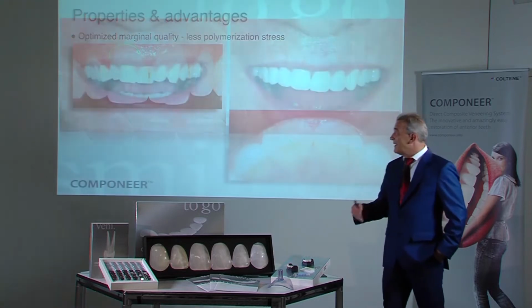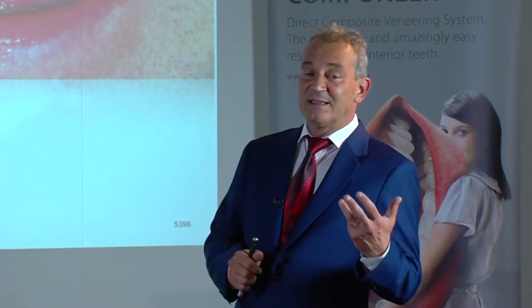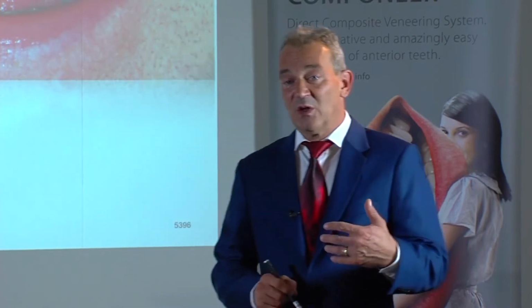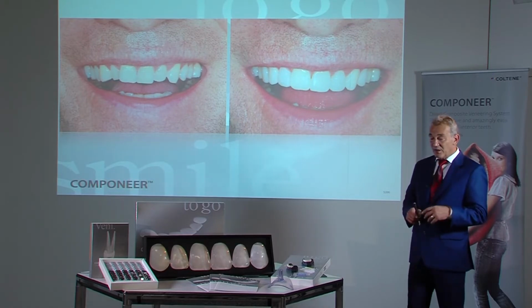If only little is to be restored, the Componeer shell is adapted to the preparation. If the position of individual teeth needs to be modified, or if the layer strength of the restoration material becomes too thick, then one needs to work with dentine material in the background.